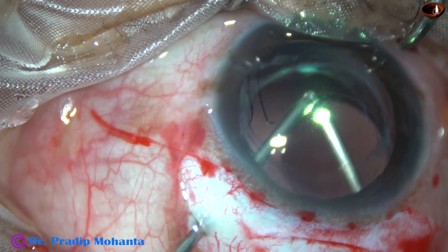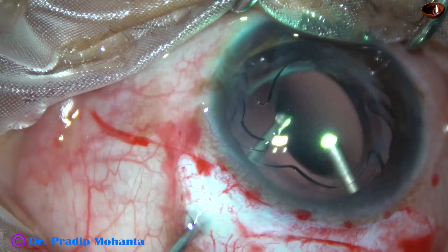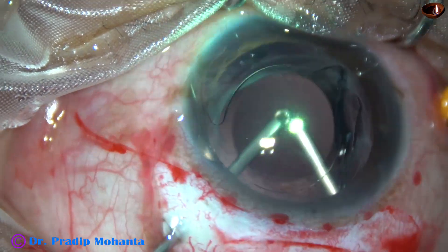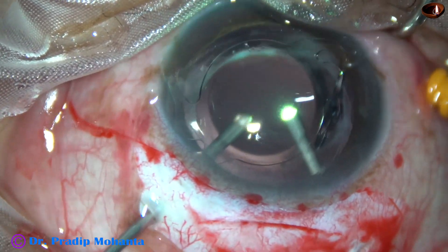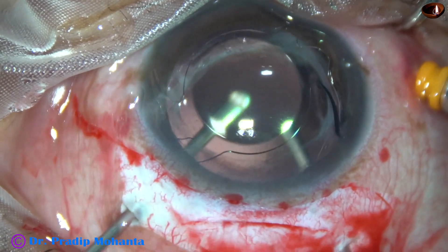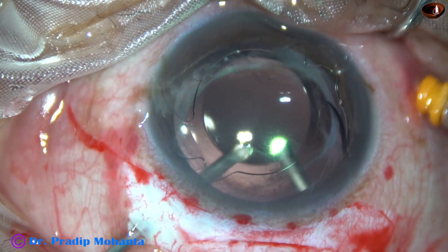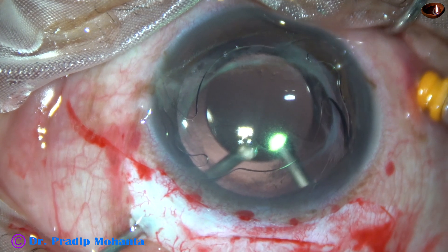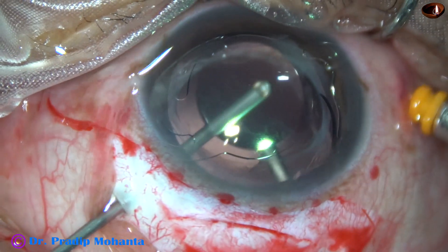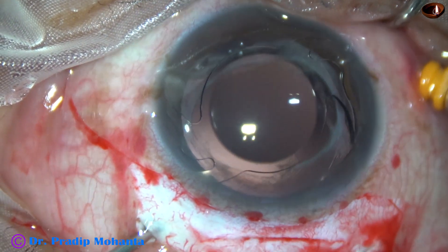After making some maneuvers, I push this lens anteriorly, and the haptics come in front of the anterior capsular rim. Very nice vitrectomy is done to cut all the vitreous strands all around.